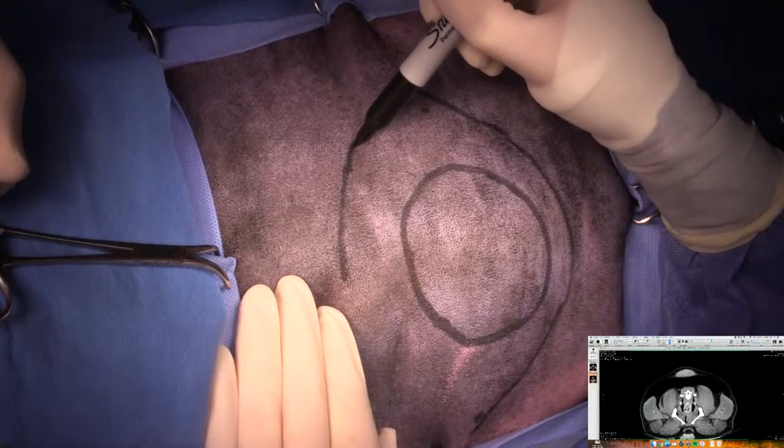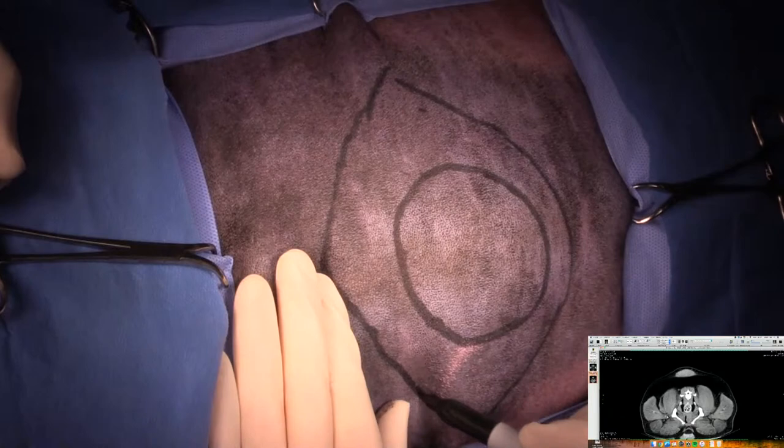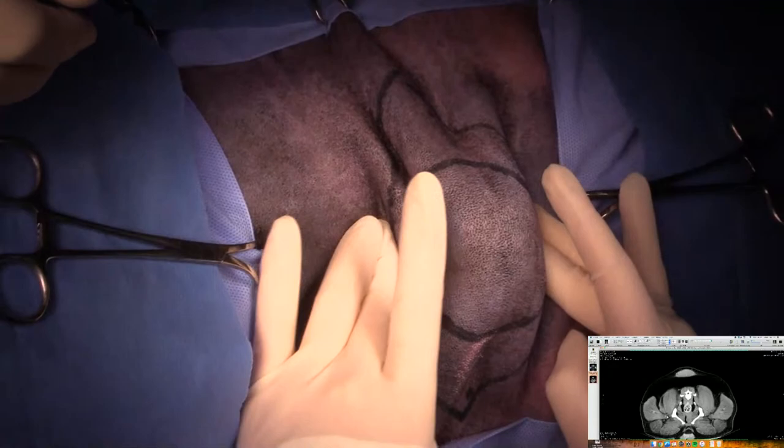And if we don't have enough skin to close here, or if it's under a bit of tension, we can always do Z-plasties if we need to later on. But this should be fine. All righty, so we'll start on our skin incision.